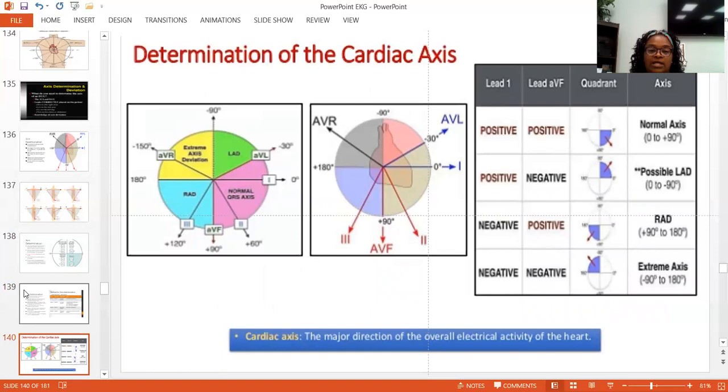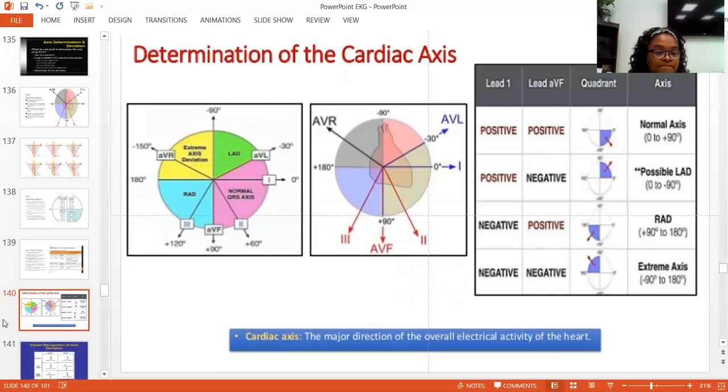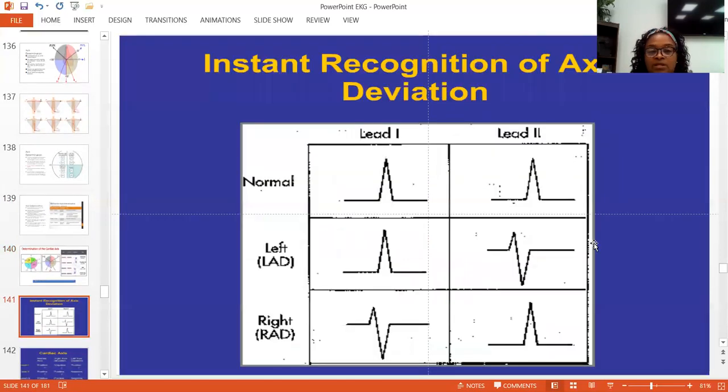Okay, and here again is just another recap, another view of everything that I just said. Like I said, pick whichever one speaks to you and learn it. Here's yet another one.